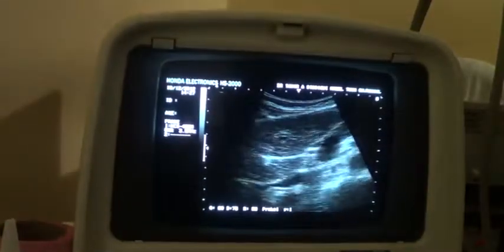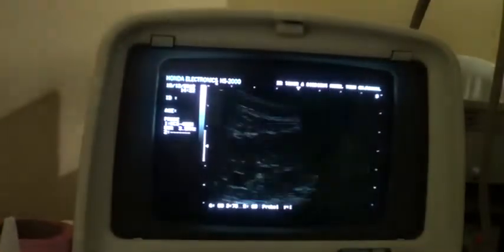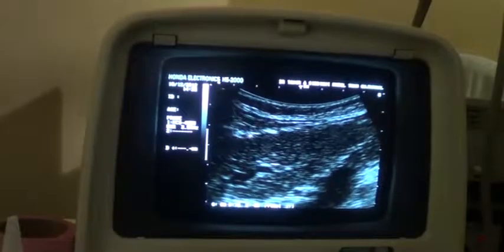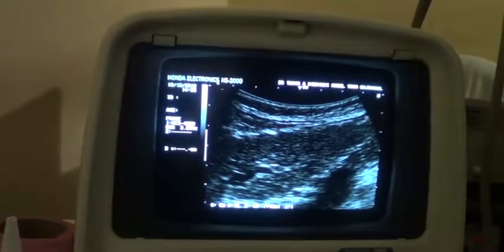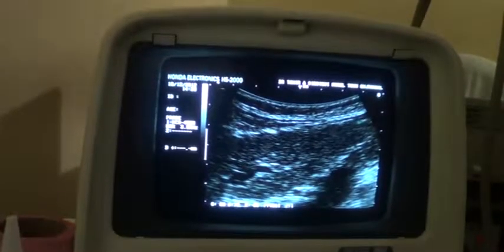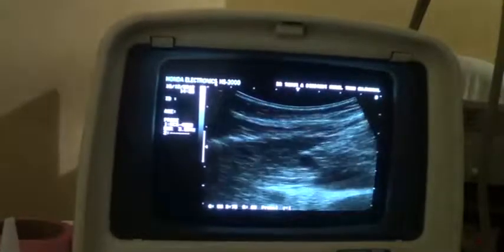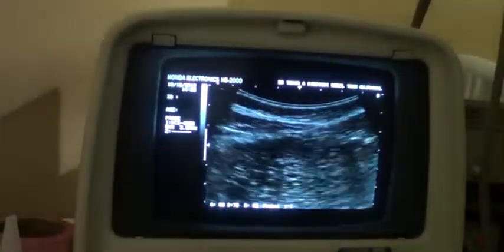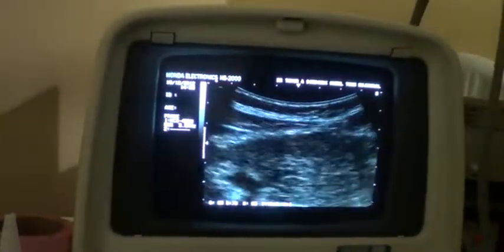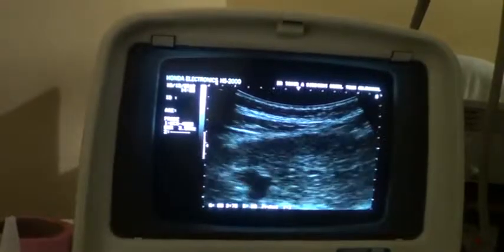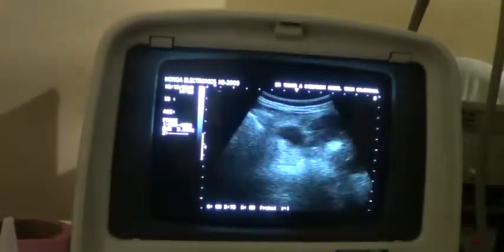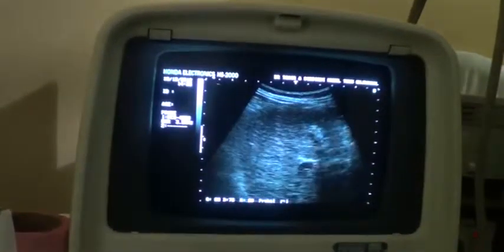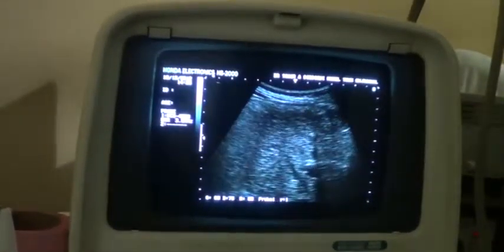See the degree of irregularity of the outer surface — this is the outer surface of the liver. Throughout the liver, all of the liver shows the same findings.